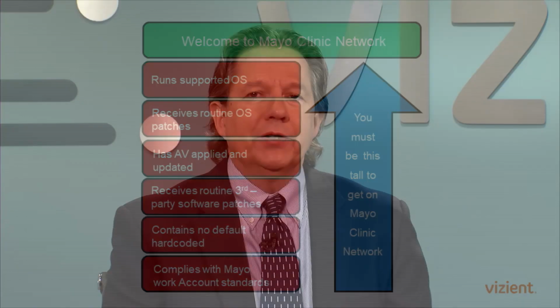And again, these are things that you need to partner with your supply chain on. And if we in security are not coming to you, it's really important for you to go to them. The other part is for the supply chain professionals. You really need to be vigilant in the contracting process and hold the vendors accountable. You'll find a lot of what you buy with medical devices won't even meet those 6 basic low-level things.